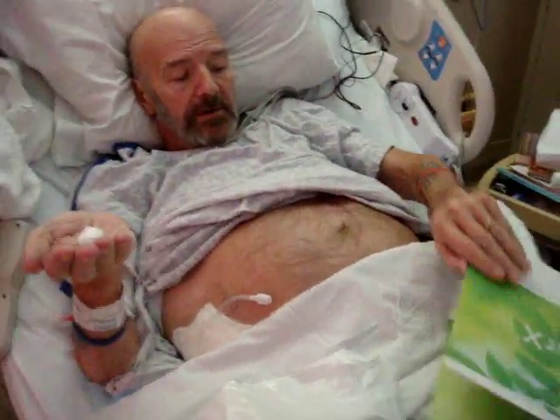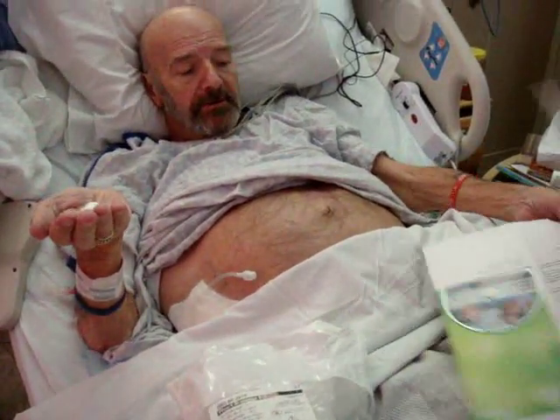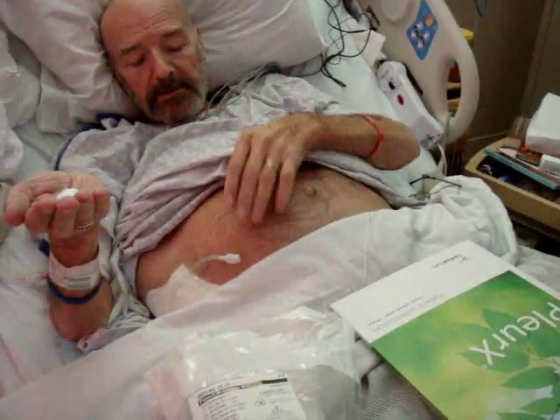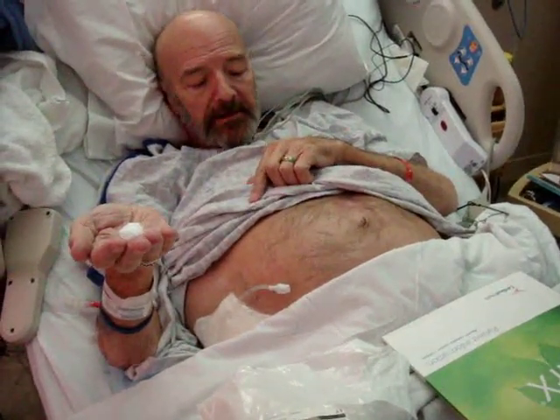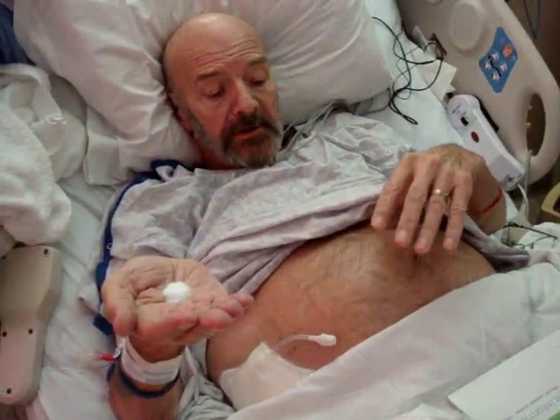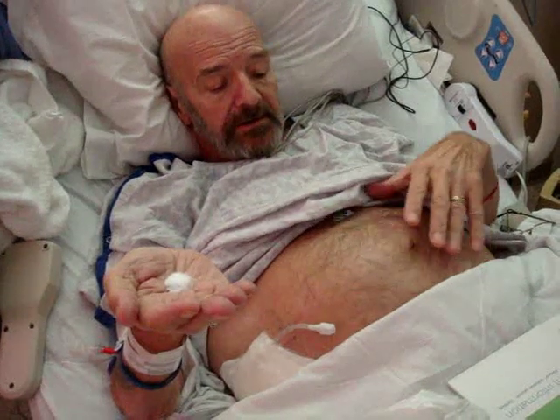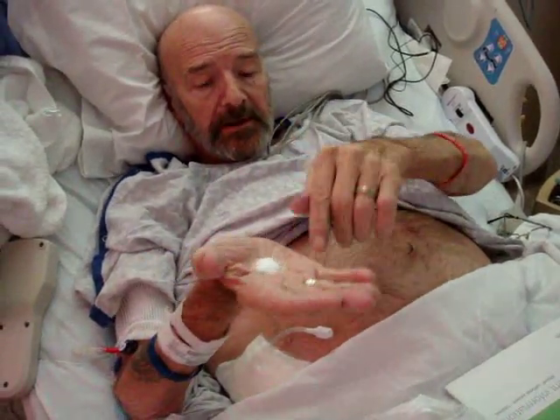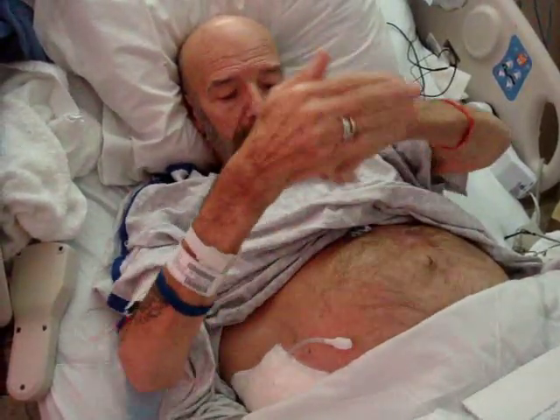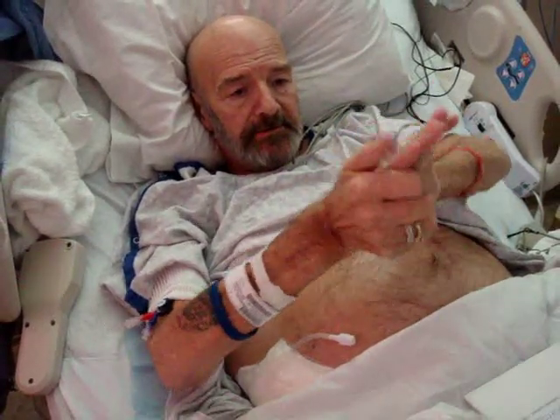Today we are going to drain the PleurX catheter, which is right here and goes into my tummy, and allows me to take off this fluid that keeps residing in my abdomen. So far, over the last week, we have already drained four and a half litres of yellow fluid. Now I'm going to sanitise my hands, wash my hands, and start the procedure for self-draining.